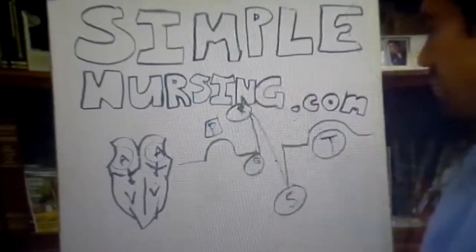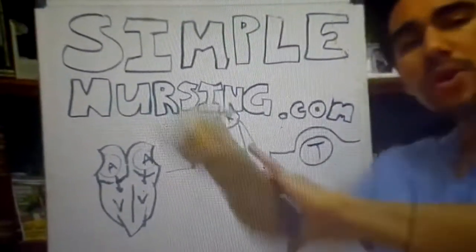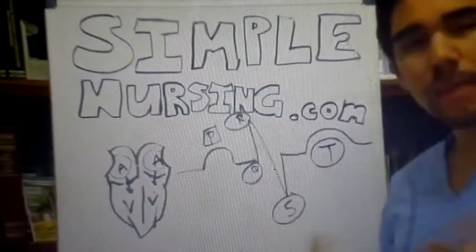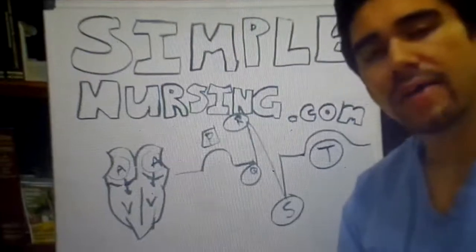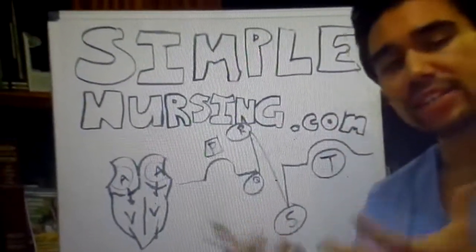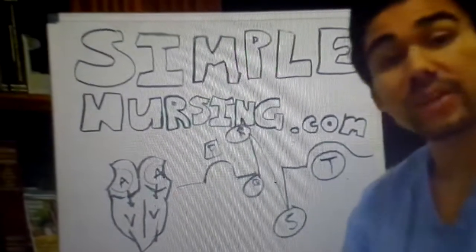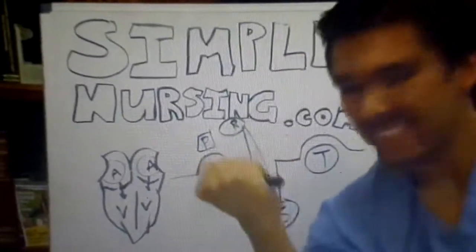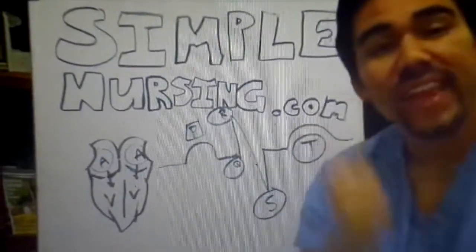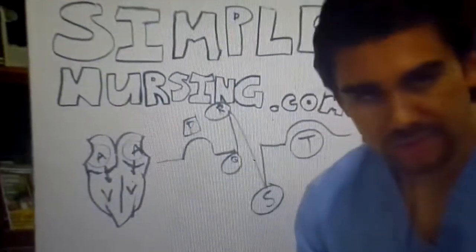Yeah, pretty much, right? So that P wave, boom, that big atrial contraction, or QRS, that boom, big ventricle contraction, and then we have that relaxation of our T wave. Basically what goes up must come down. Yeah, caught it. And then the whole cycle happens all over again.